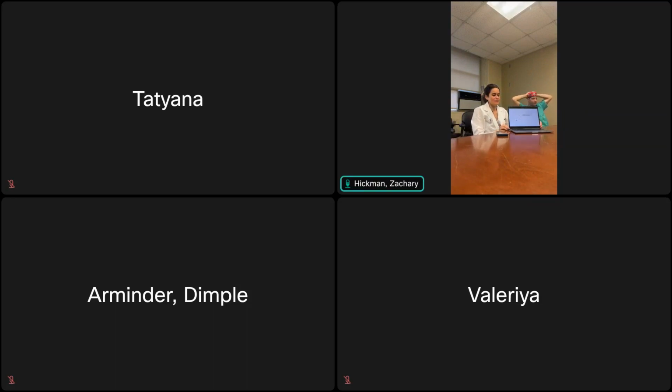So you hope to have three peaks in your waveform: P1, P2, P3. P1 comes from your arterial pulse. P2, we usually use to assess compliance. And P3 is kind of like the venous component, or I was going to say diastolic, something like that.